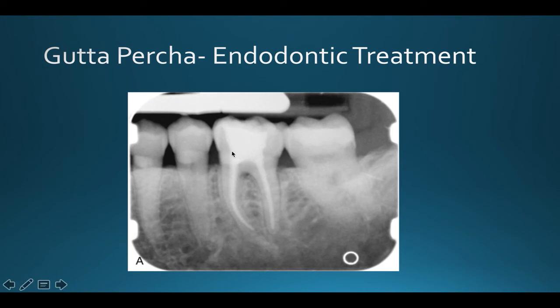We can see here when we look at this image, here's our gutta percha. It's just slightly more radiopaque. When I look at this dental image, there's another thing I want you to be looking at too. We have some composite restorations here. Here I am looking at tooth number 18. We can't just follow the entire enamel around. We can see this very slightly more radiopaque area here. So we've got DO, and I don't see anything on the mesial, so this is a DO composite.